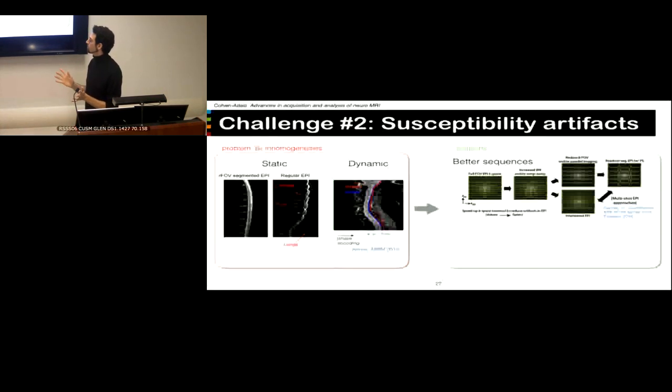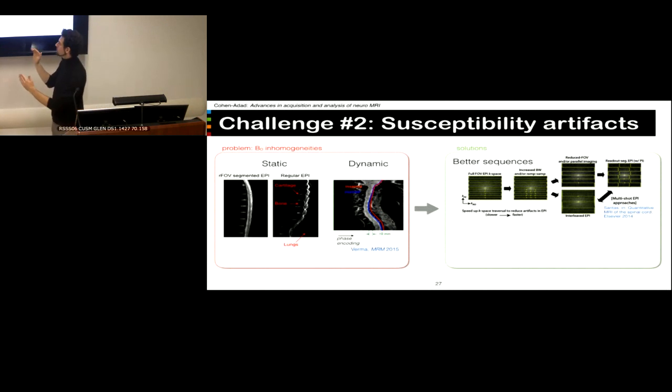And you might have heard about parallel imaging, which is a way to acquire the k-space faster. There is also the reduced FOV technique, which is similar to the parallel imaging approach, but with reduced FOV, instead of acquiring a square, we reduce the FOV in this direction, and therefore we can reduce the number of phase lines in the same direction. By reducing the amount of phase lines, we fill the k-space much faster.